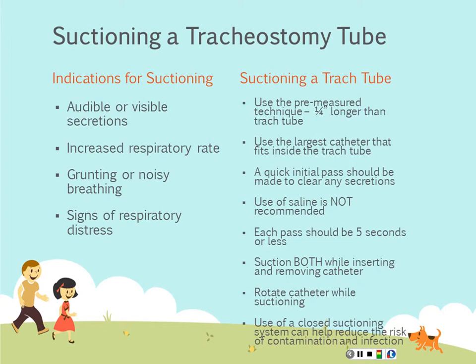And then many of our patients will have a sign at the bedside, for example, that might say, "Hi, my name's John, and I have a 5.5 uncuffed PD Shiley trach, and you will suction me no further than XX centimeters." Or if there's colors on your suction catheter, no further than the red line. And that kind of gives you a better idea, and that way everyone knows the safest technique and length to use so they don't go too far and further irritate the airway.